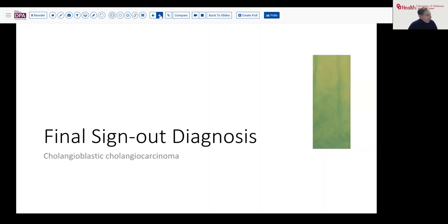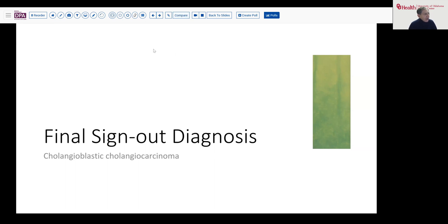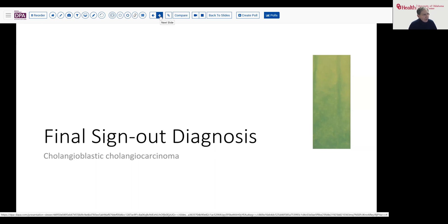I hope you enjoyed that case. Our final sign-out diagnosis is cholangioblastic cholangiocarcinoma — not the most common tumor to find in the liver, but it does illustrate the value of both comparing prior surgical material, as well as knowing the literature and doing a complete panel of considerations to rule out or establish your final diagnosis.